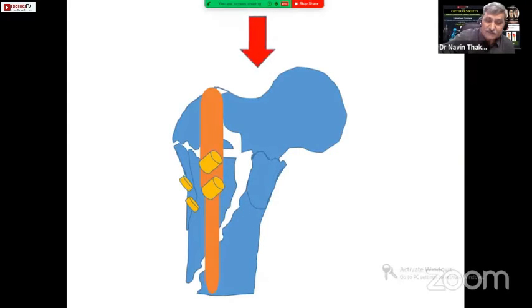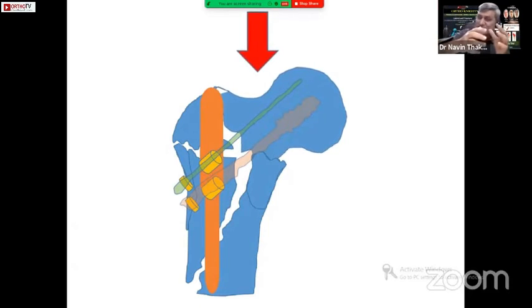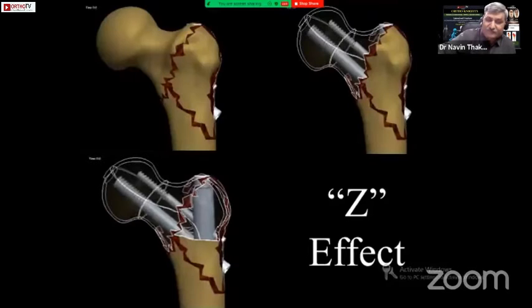The continuous varus force is there, and the concentricity of both the bony canal, which was intact, and the canal within the nail that works as a barrel, just like a DHS barrel, goes away. There is no concentricity. So that axis of the collapse gets blocked.